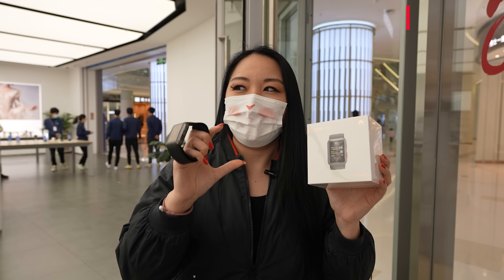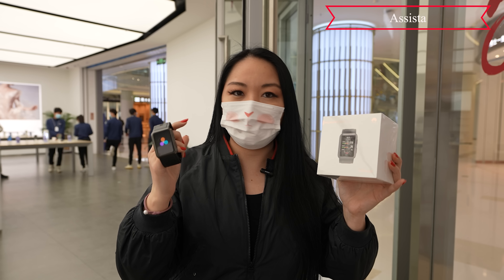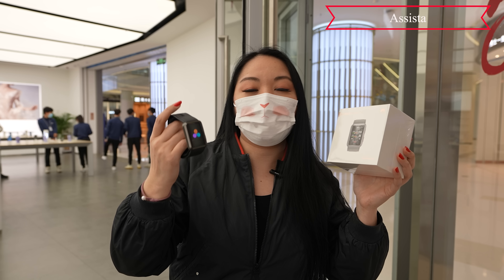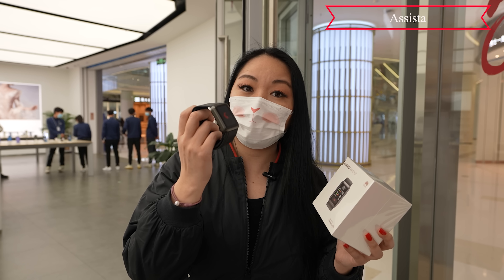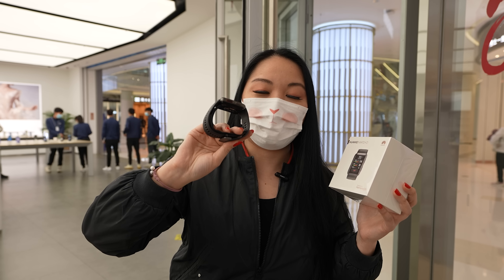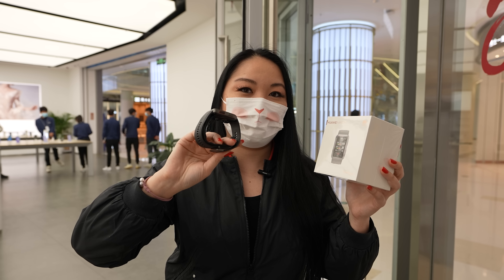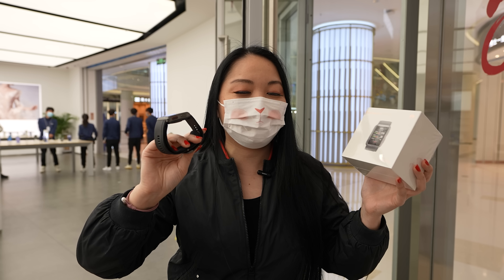I was seeing that every doctor will have a quite small fee, but apparently it's only for here. I don't know more details about this because it's a very new device, but let's try to discover it. It has a part at the back that inflates to be able to measure arterial pressure, and besides that, it has all the functions of a smartwatch too.